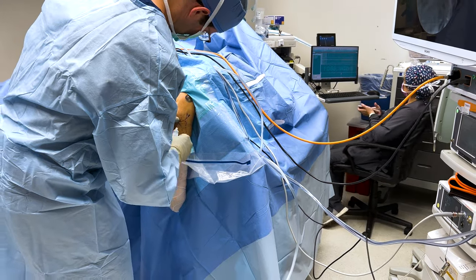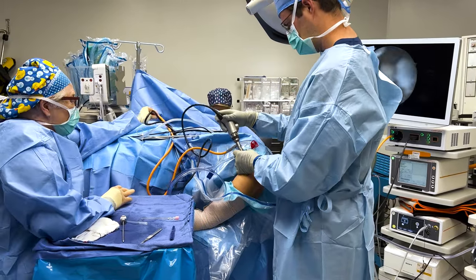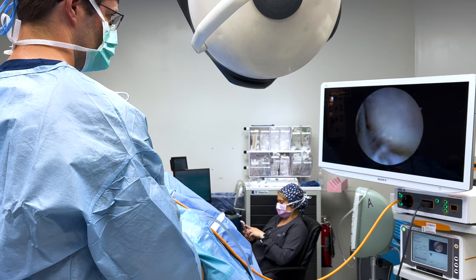We will fill the elbow with fluid. This is going to help us get a better view of the joint and it reduces the risk to the surrounding nerves and blood vessels.